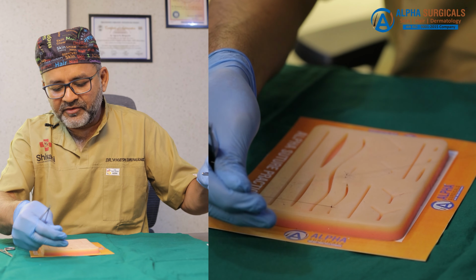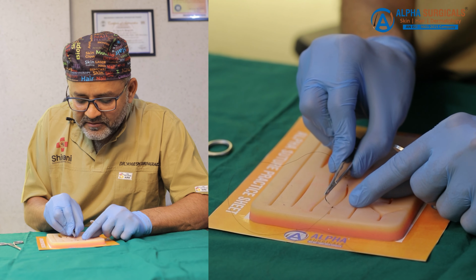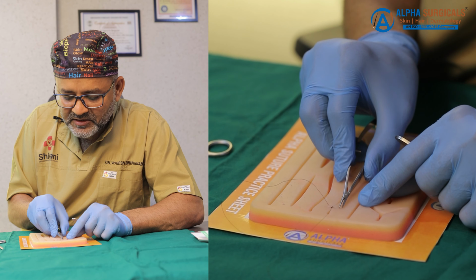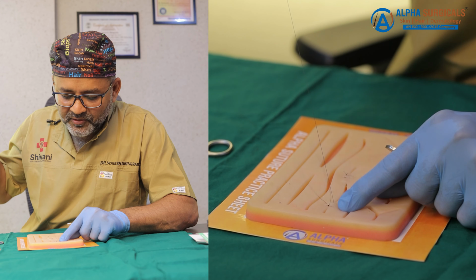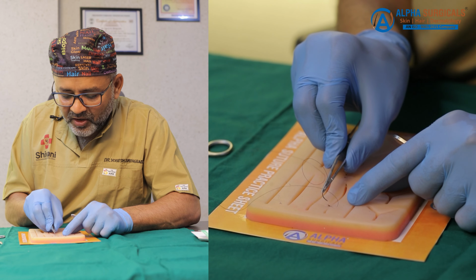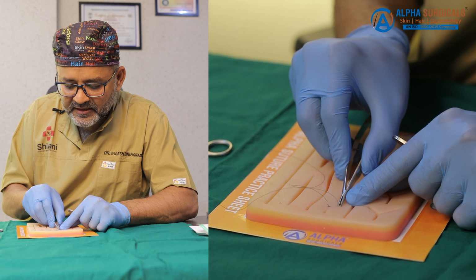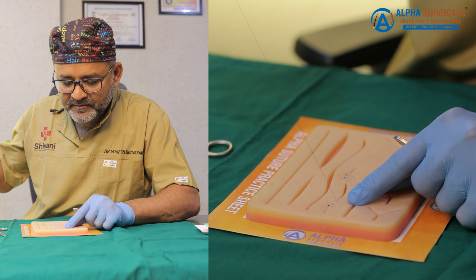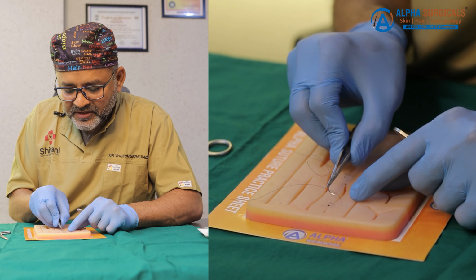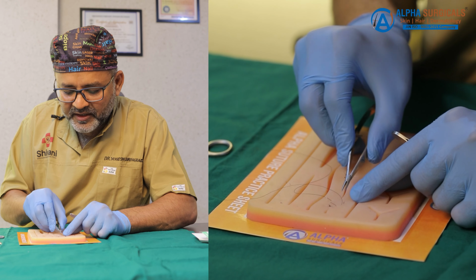So now I will be giving the suture continuously. Entering from one side, exiting from another side, taking the thread out. In the same manner, repetition of the same movement, entering from one side, exiting from another side, not creating much tension. Tension is created just to give apposition of the wound margin.